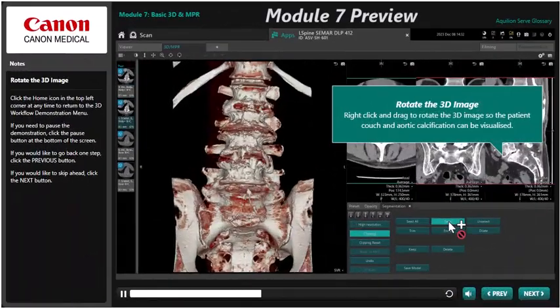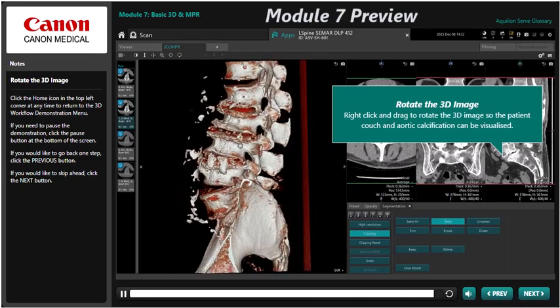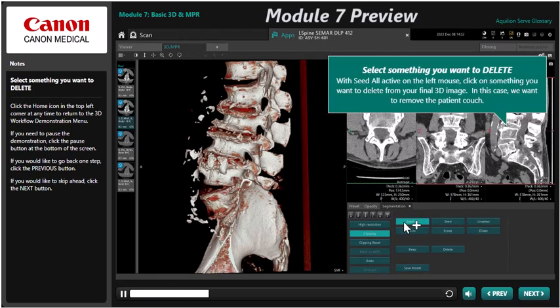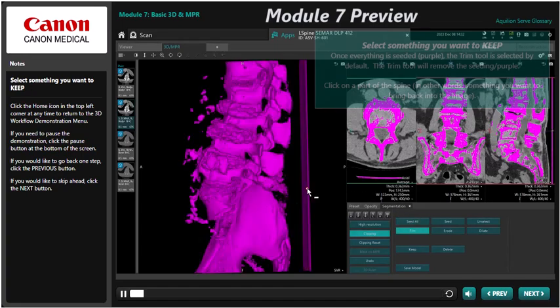In Module 7, you will learn about the 3D MPR interface. This will include an in-depth explanation of all 3D and MPR tools, along with workflow demonstrations for producing a batch MPR and two common 3D workups.